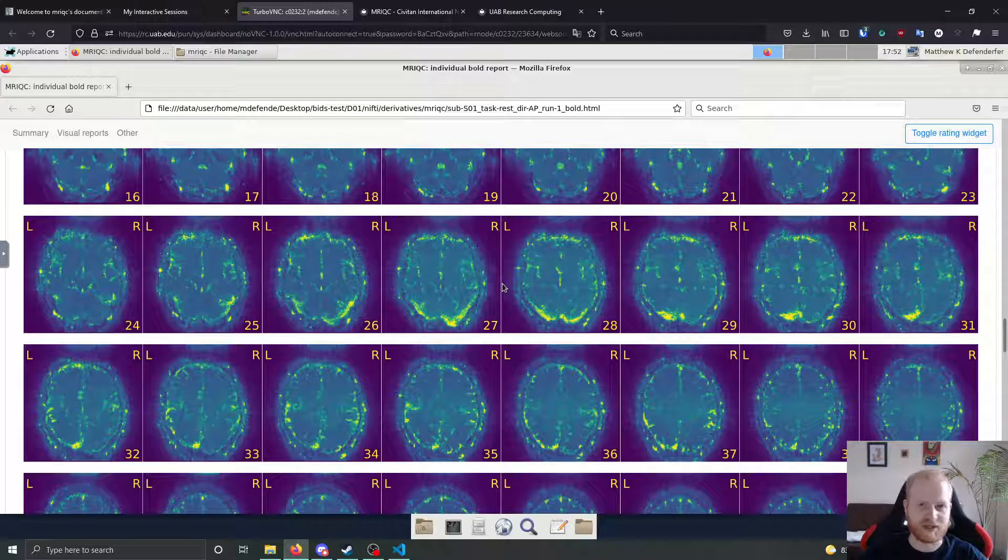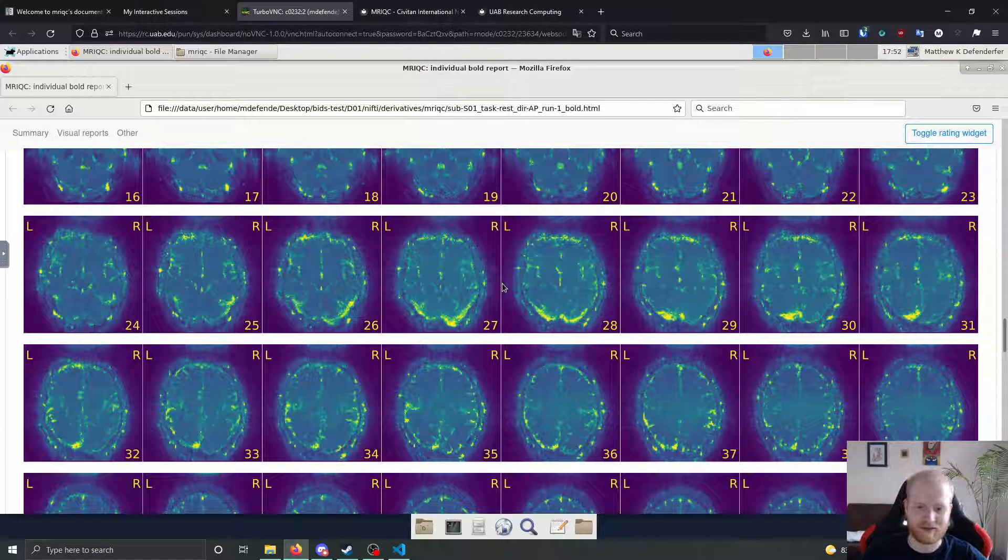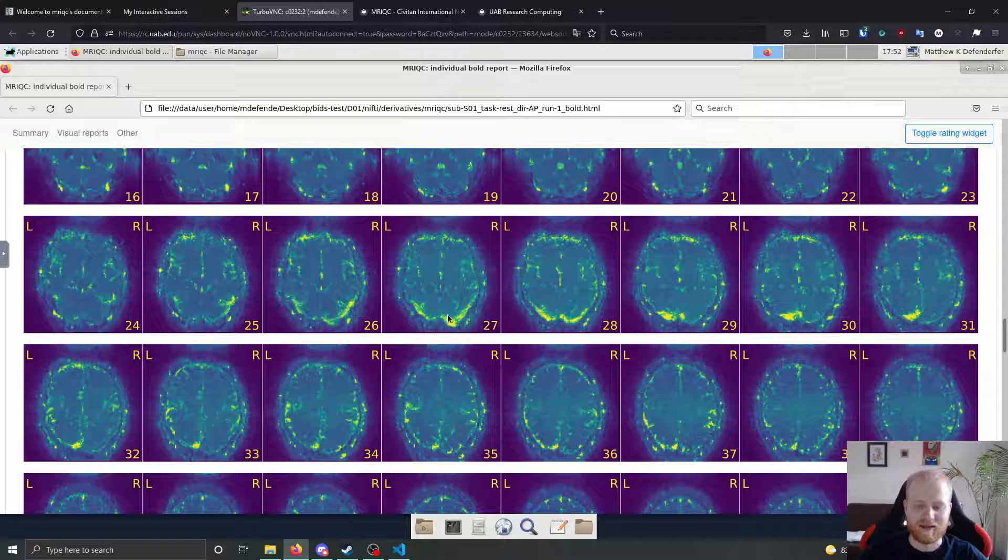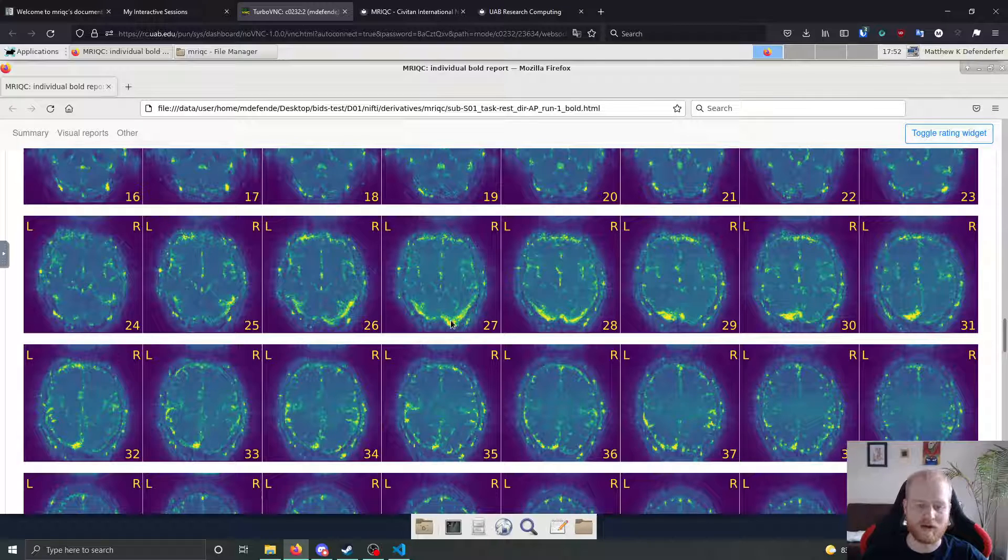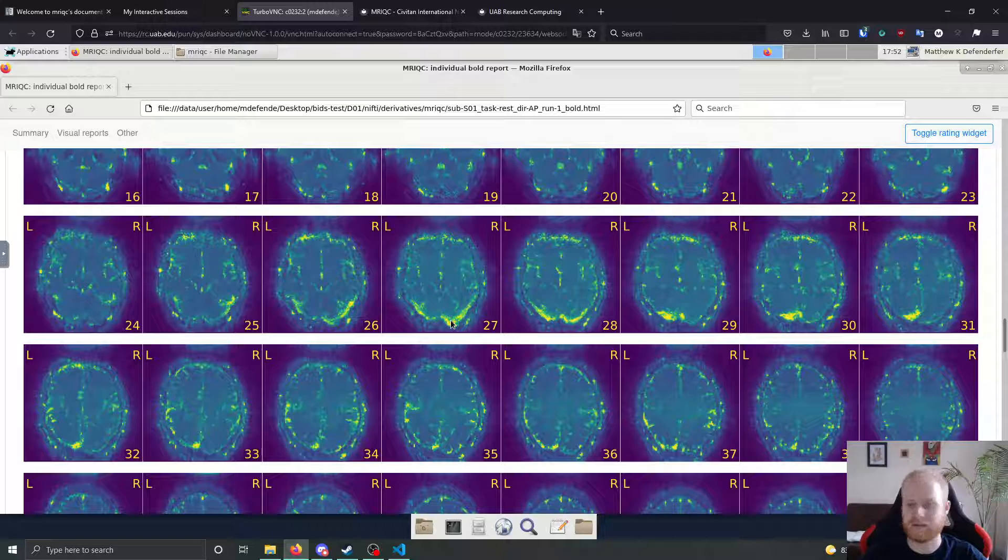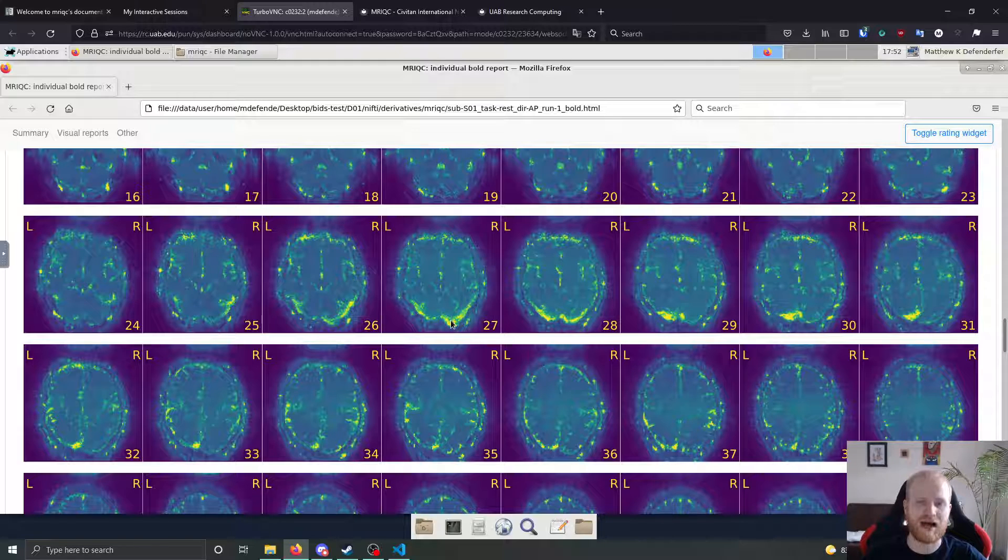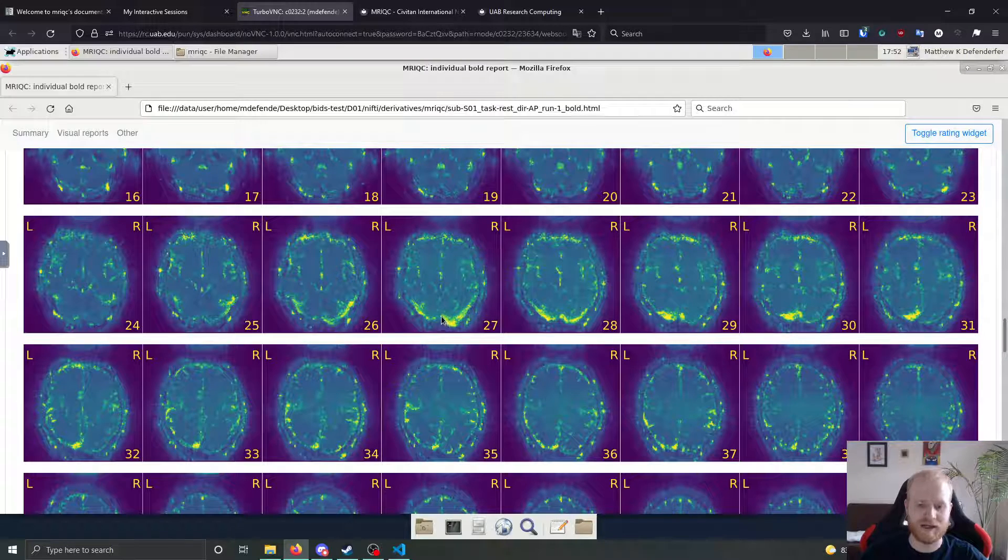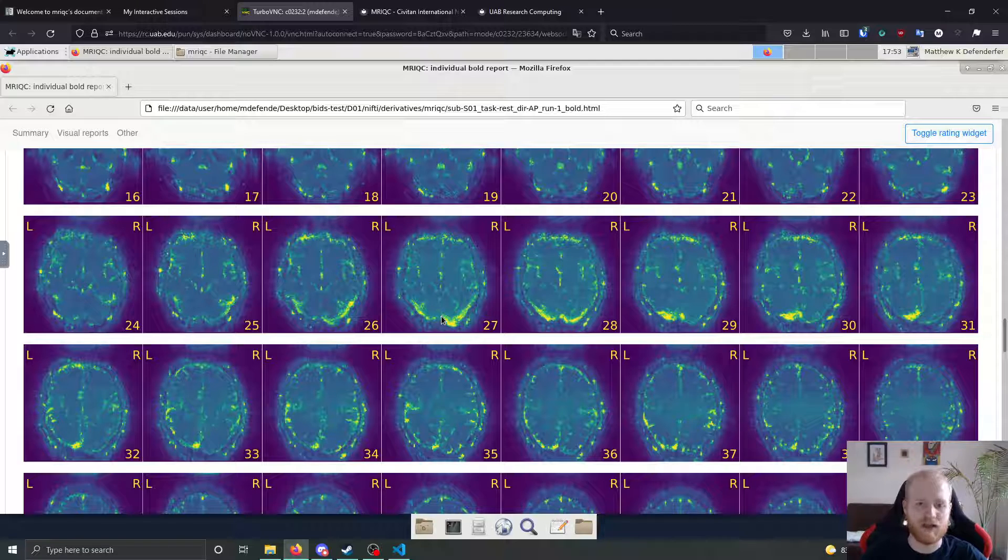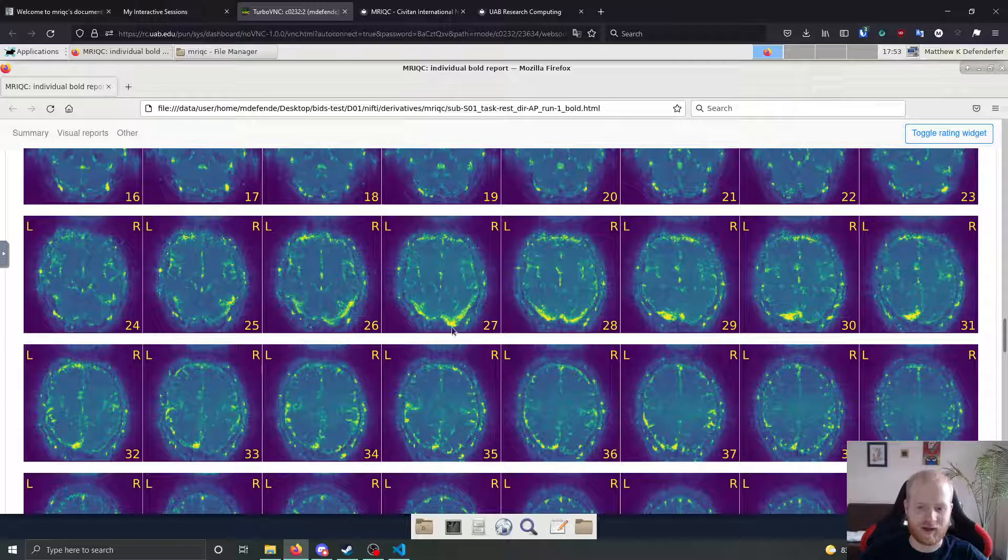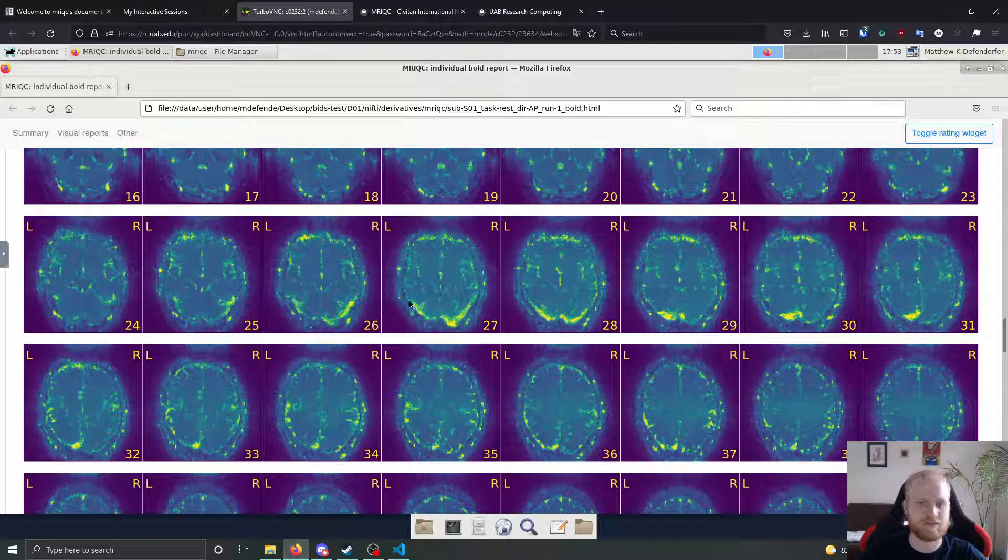You do get areas of high standard deviation along the edges of the brain and then some of the major blood vessels that go through the brain. Blood vessels, just because blood is flowing through them, it's going to give you pretty distinct different values. And then at the edge of the brain, there might be slight movement causing these voxels to have brain or CSF or skull or empty space, depending on how much movement there is. There could be those tissue types in that voxel at any given point in each of the volumes. So what you want is this low standard deviation across the entire brain, whereas some high standard deviation across the edges is fine for the most part.